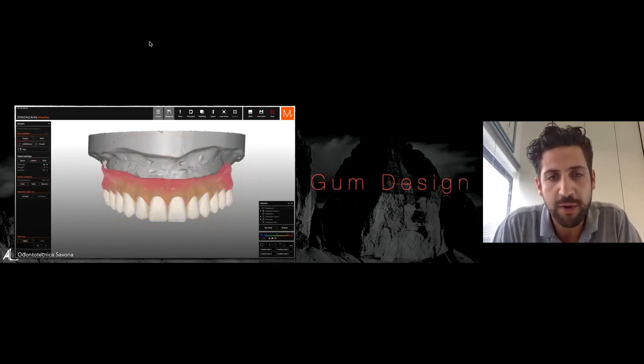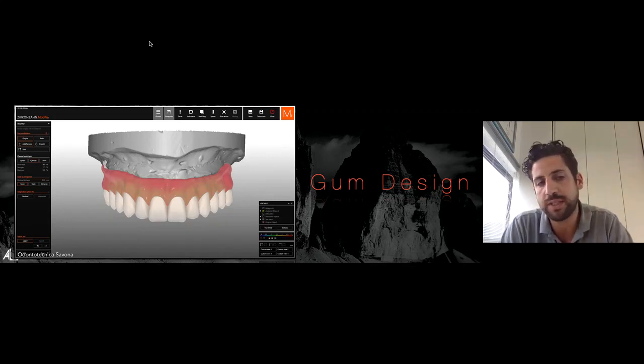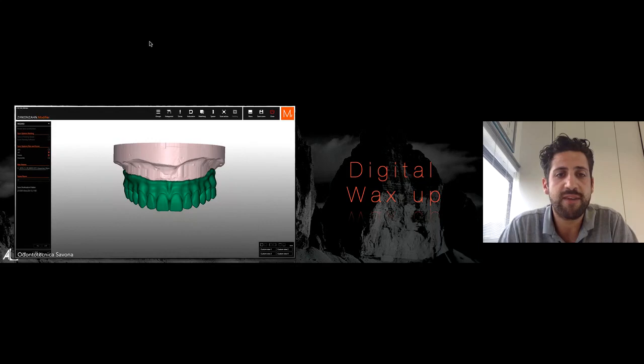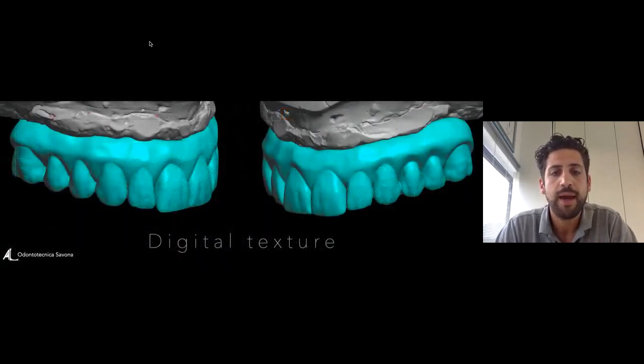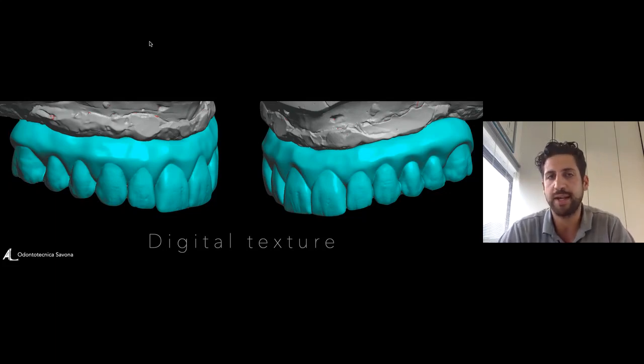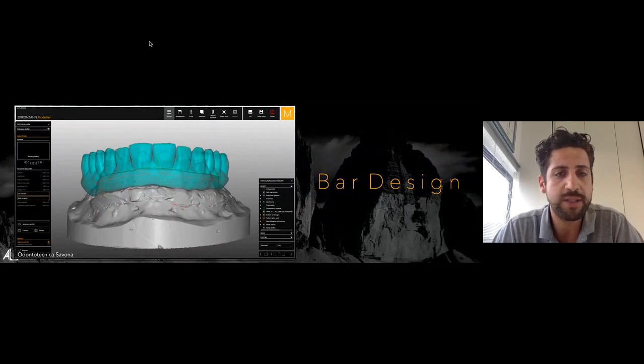And you can also see the difference between the old program and this program, because in this program we can get the real color of the teeth and the real color of the gingiva, and especially if you use face scans, it looks much more natural. This is the final wax-up, so we match together the teeth and gingiva. When our wax-up is done, we can import our file into the Modifier to finish the case. So we made a little digital texture before the milling, and we use this wax-up as a reference, like in the previous case, to make our individual bar.